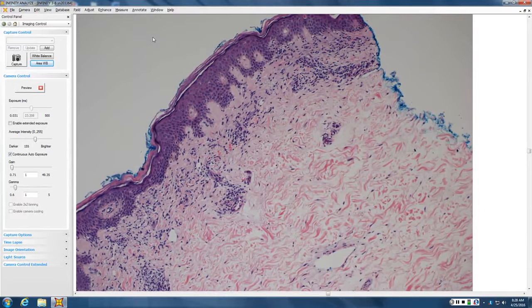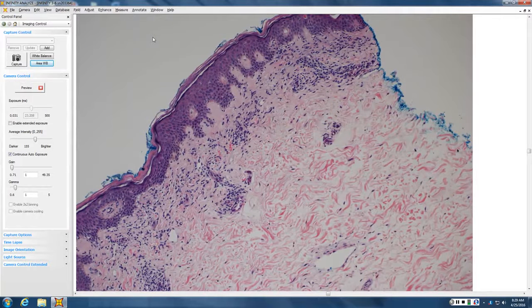Tell me your differential for a lymph in every hole. I think like PLEVA or PLC. PLEVA and PLC, and there's a little red cell extravasation, which might suggest PLEVA or PLC. Spongiotic, sorry. MF. That's what I would think about. Also the early evolving stage of a benign lichenoid keratosis can be lymph in every hole. Syphilis can be lymph in every hole. That's about it for the list.